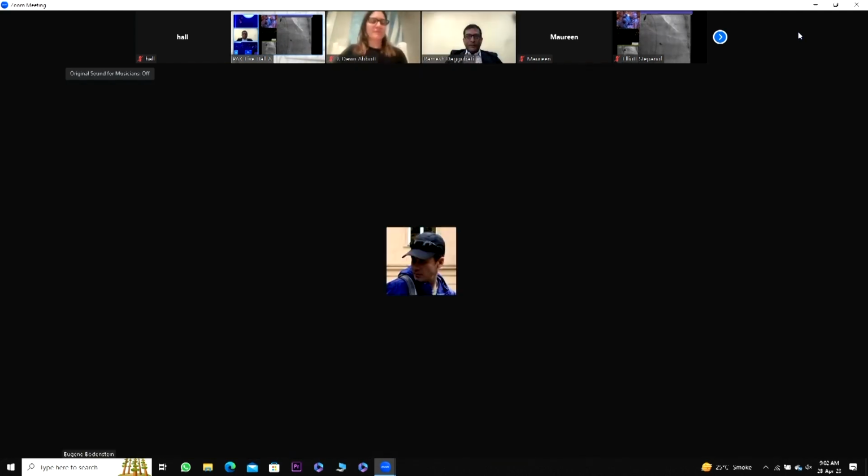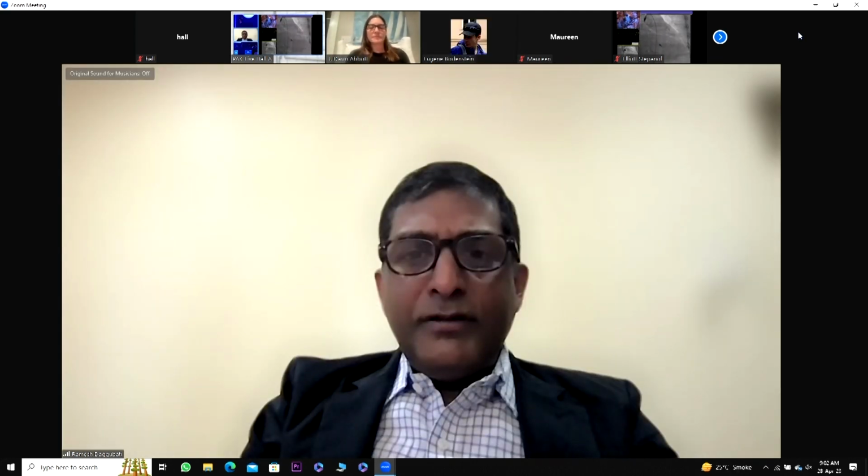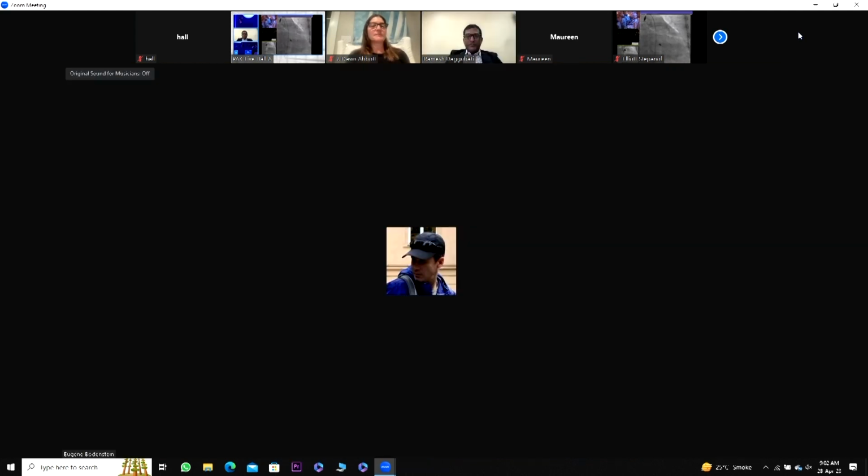Xiaoling, I missed that comment. Sorry, what did you say? You're going to remove the side branch wire, right, Shami? Yes, that's what you're saying. First, let me just get this all positioned up. I think we're in a good spot.